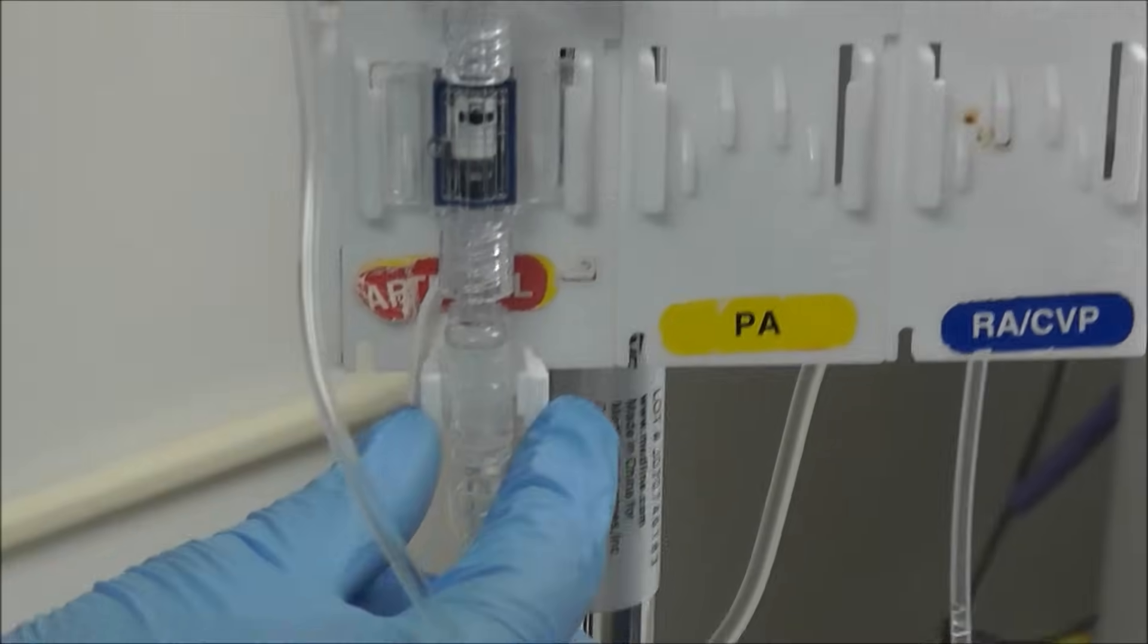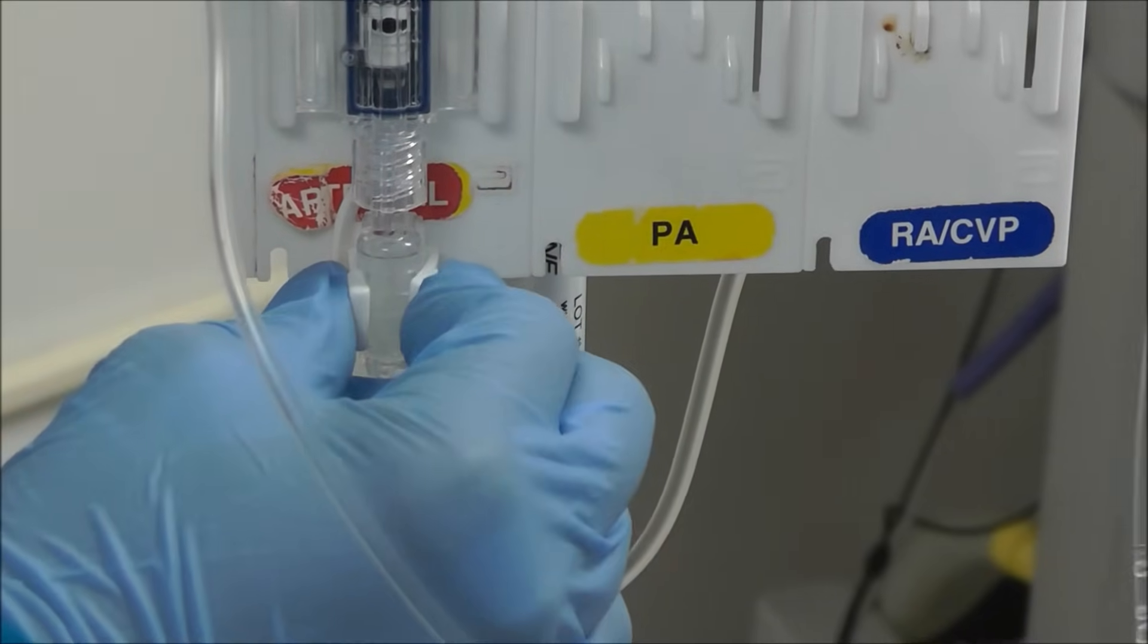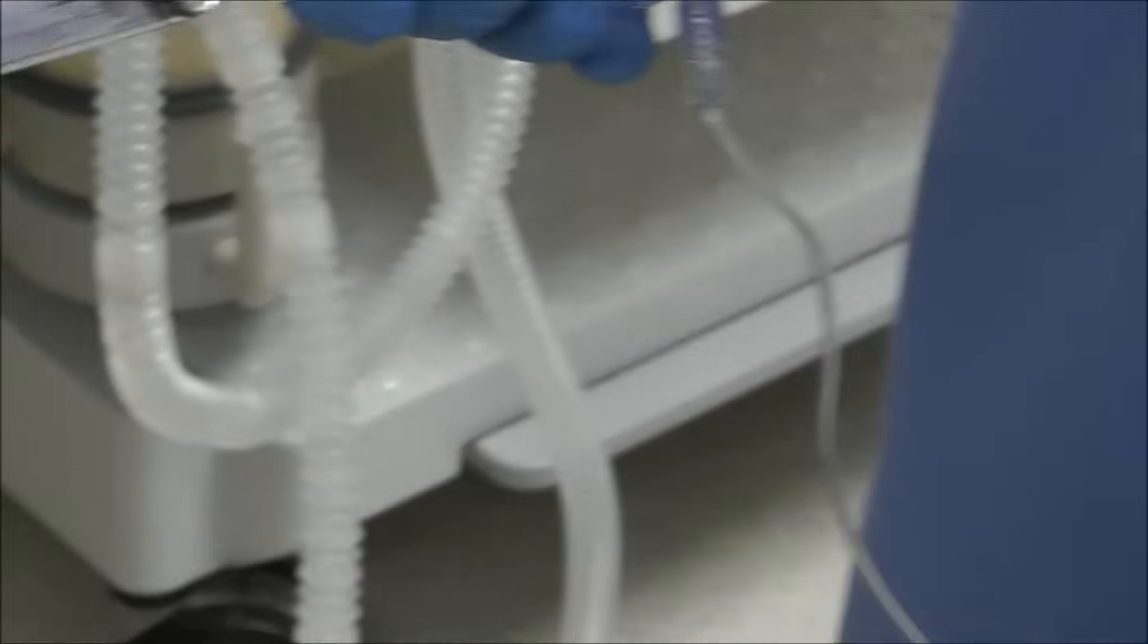Here's how you flush it. Push. Push in. Push in. And allow all the air to come out of your tubing. And we see that all the air is out. We've flushed the A-line. We're almost done here.